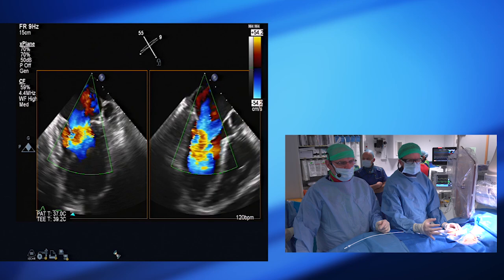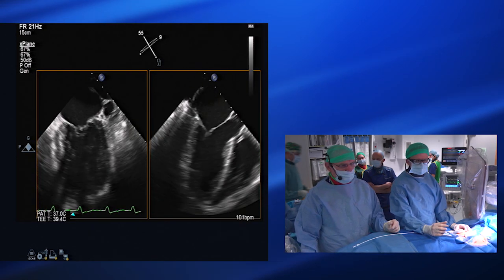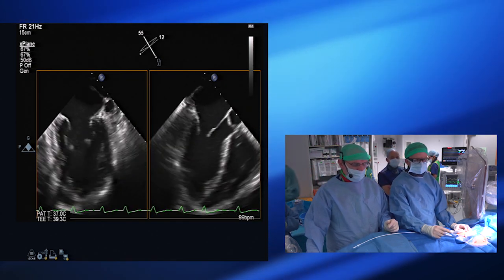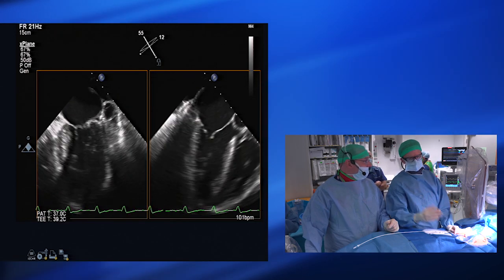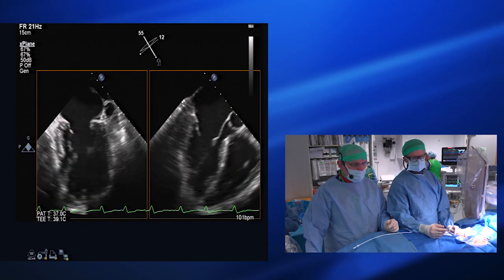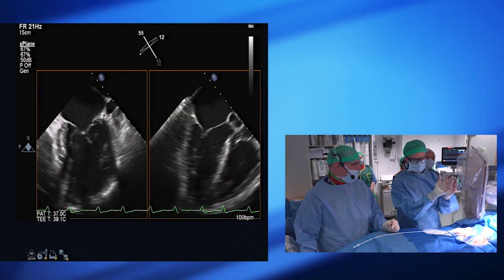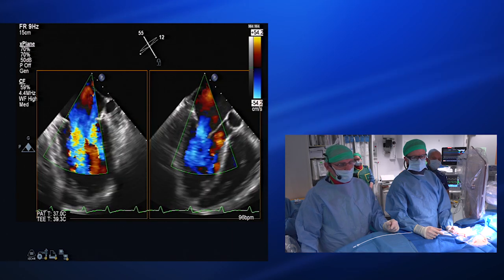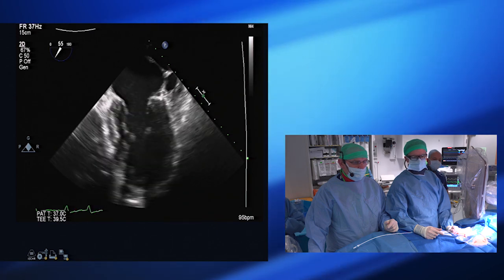The way we do this is to use the bicommissural view to get the LVOT view, and that is how we do most of the procedure. There's a pretty broad jet — it's worse on the medial side, on the left of the image. I think we're going to need more than one clip. Generally speaking it's easier to clip from medial to lateral rather than lateral to medial, so I'll try to place the larger version of the clip — the XTR — on the medial side of the jet. We'll leave not too much residual mitral regurgitation medially so we can then add another clip on the lateral side. This man has torrential MR, so it would be nice if we got mild or less, but I would be very happy if we got moderate.